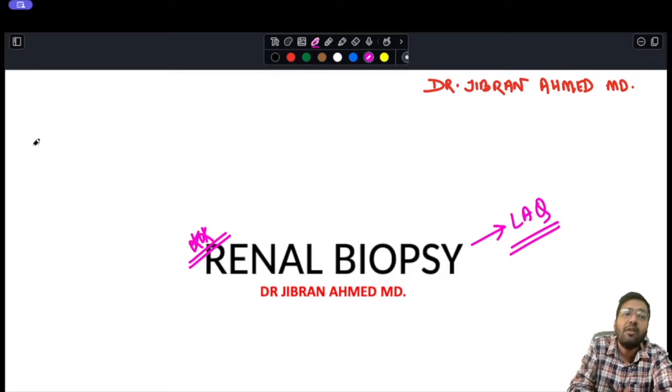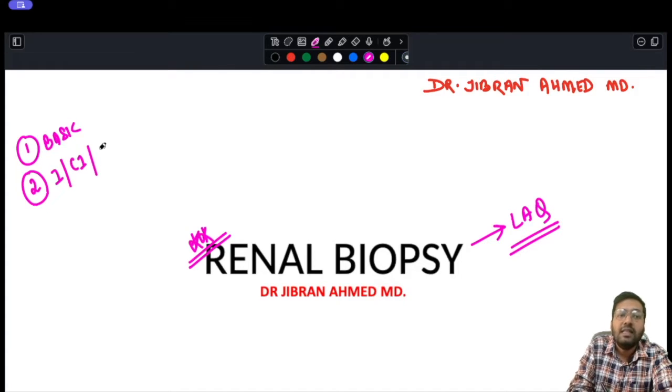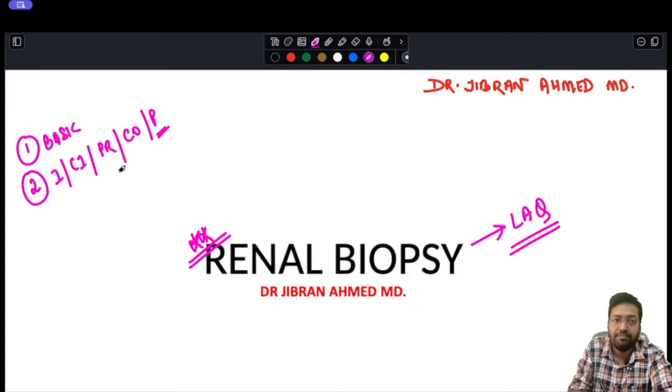So what are the things that we are going to discuss in today's topic? We are going to see the basics of renal biopsy, followed by the indications, contraindications, the prerequisites, the complications, and the procedure in detail.